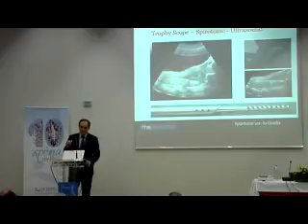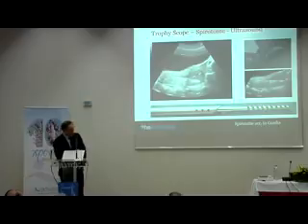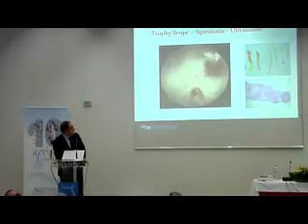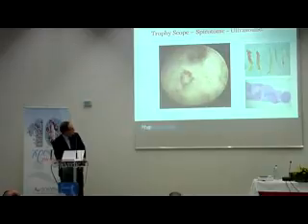Does it hurt? It hurts a little bit. Every cut hurts a little bit, but we inform the patient, and it is absolutely tolerable doing this without any form of anesthesia. And we did it twice, and I will show you the results. So those are the samplings in breast biopsy using the same technology. So very, very long tissue samplings.